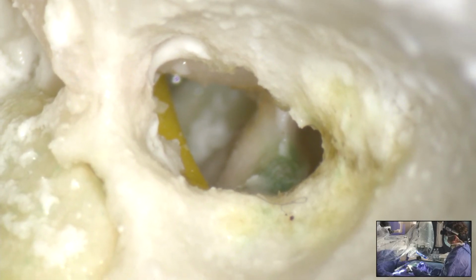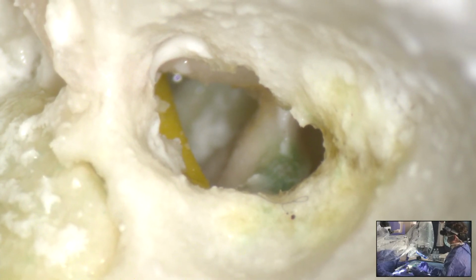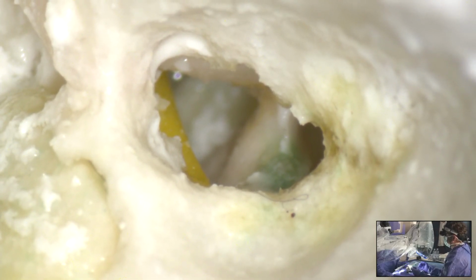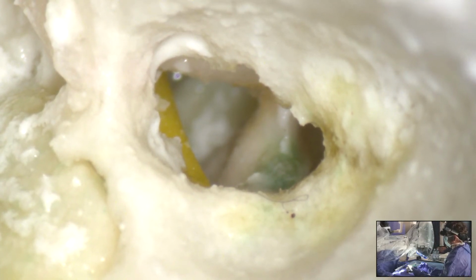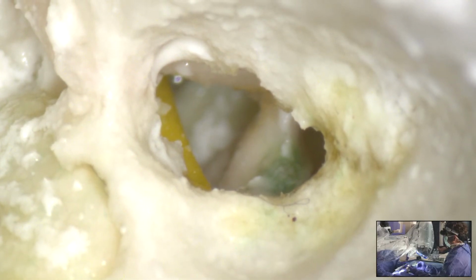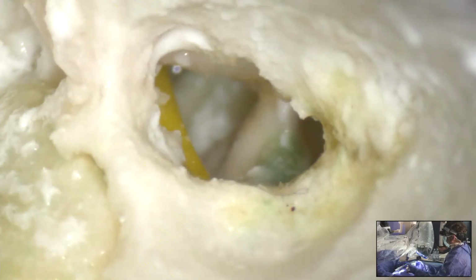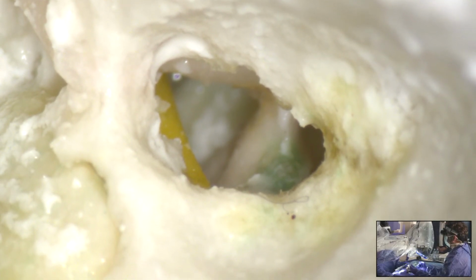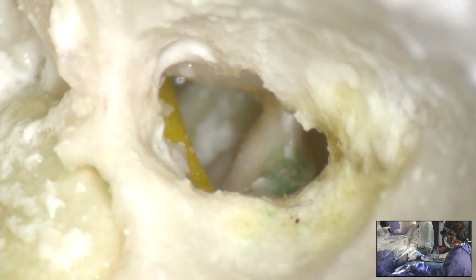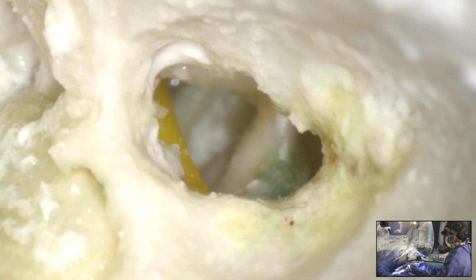So if you have to search for landmarks, it's very good to get an overview, and it's on the other hand perfect to visualize landmarks, to identify landmarks, and so I think it's a very big advantage. Another big advantage is that I don't have to take my hands out of the surgical field to move the scope. So this is perfect because I can still have my suction inside, I can still have my needle inside, and can manipulate by moving the picture, moving the angle of the view on the surgical field.